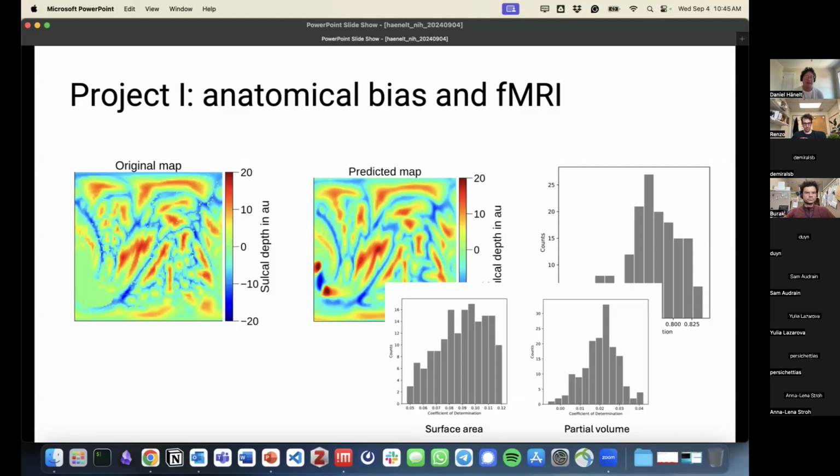These are still results I just got recently, and I have to do some controls, so that I'm sure that the network really learns valuable information and not only the mean sulcal depth topography across subjects, because we know these cortical folding patterns also have some similarity across subjects.